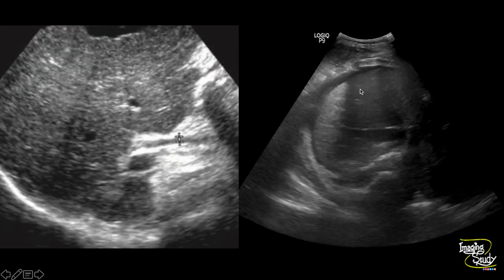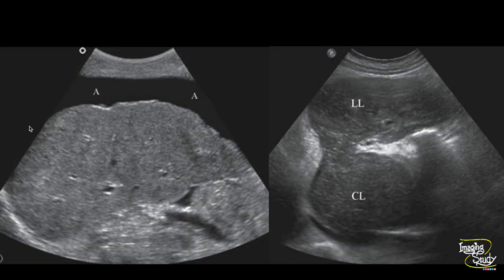Here you can see the liver contour varies greatly as shown here, where a large nodule protrudes from the deep liver border. On the right image, you can see a shrunken cirrhotic right lobe with ascites. Here again a nodular hepatic margin with ascites. Here you can see the enlarged caudate lobe with an overall coarse hepatic parenchyma.